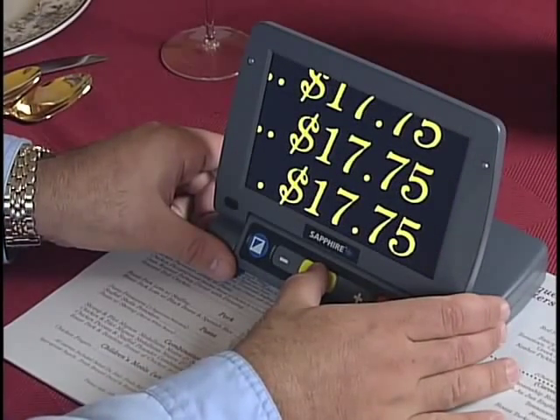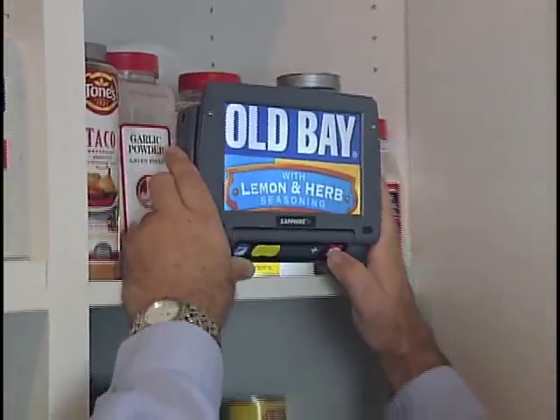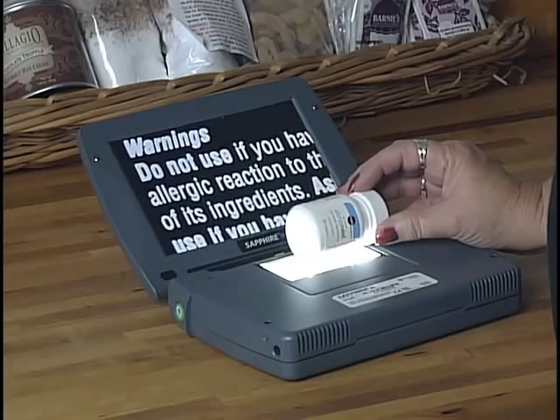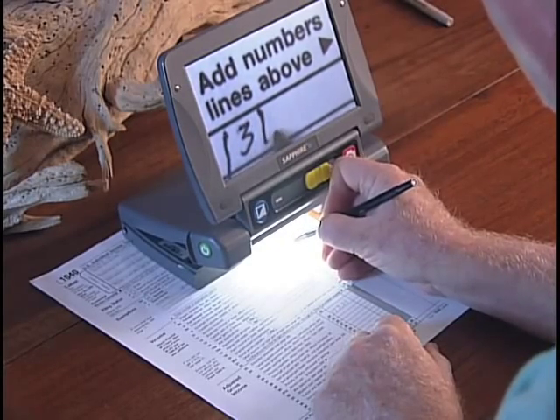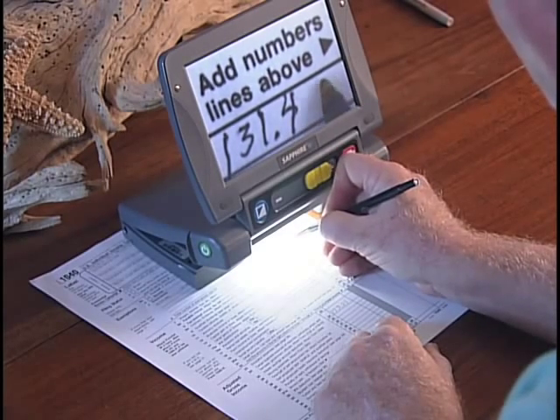With Sapphire, there's no need to rely on others to read the menu to you. Use the freeze frame feature to capture images of labels on high shelves and bring them close for easy reading. With the camera facing up, even those tiny pill bottle labels are no longer a mystery. Flip down the built-in writing stand to fill in forms, do puzzles, or write checks.